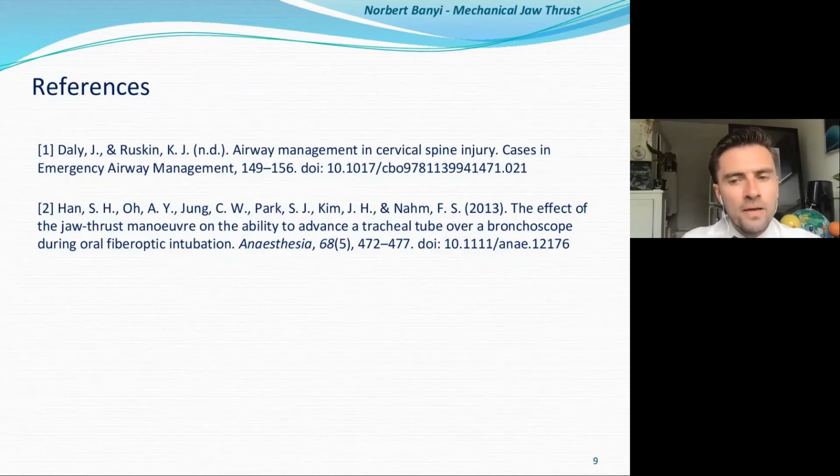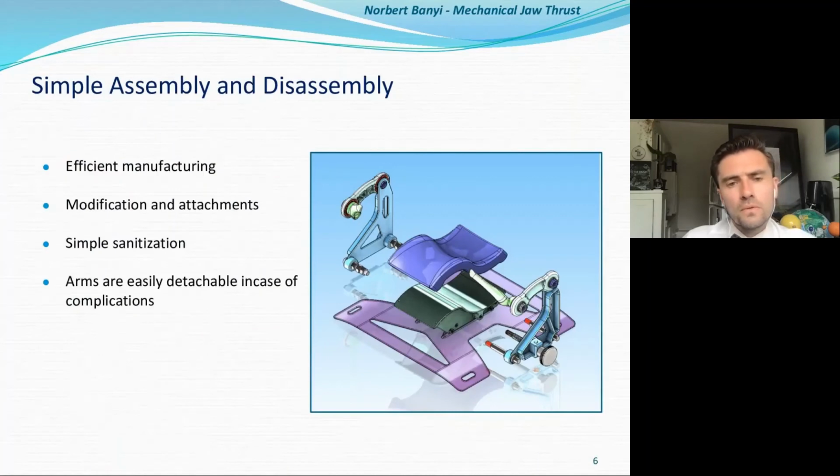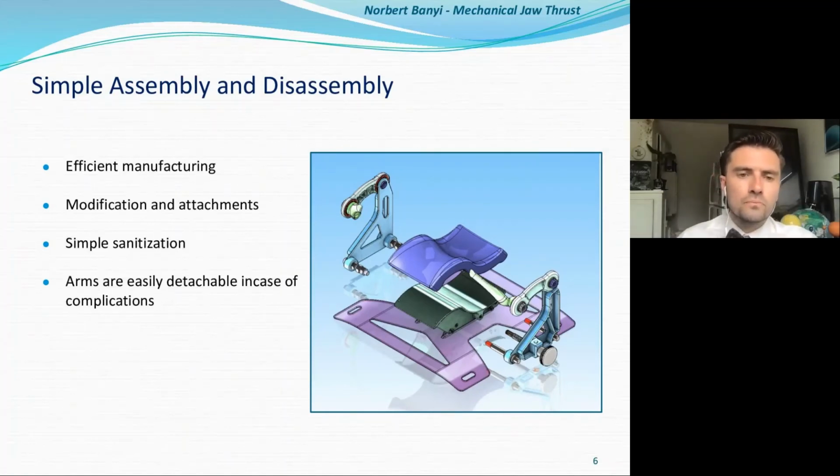Wendy follows up that question. Sometimes people need to be intubated quite quickly. How easy is it to remove? To remove the device? Yeah. And yes, so the device, here, I'll show you on this slide. The two arms actually rip off really quickly. So it would be as if the patient was just lying on a bed with their head in a headrest. And that allows you to quickly remove the patient if there's an emergency. As well, the two arms flip up. So if you need to take the patient out without ripping the two sides off, you can flip the two arms up and take the patient out that way.